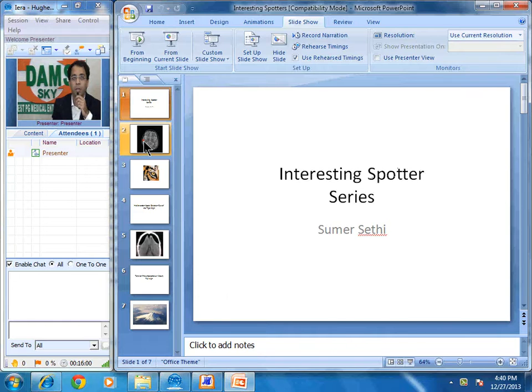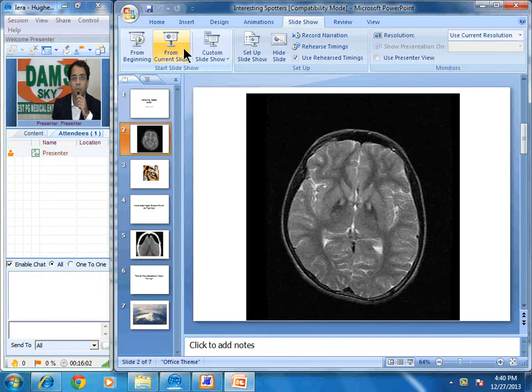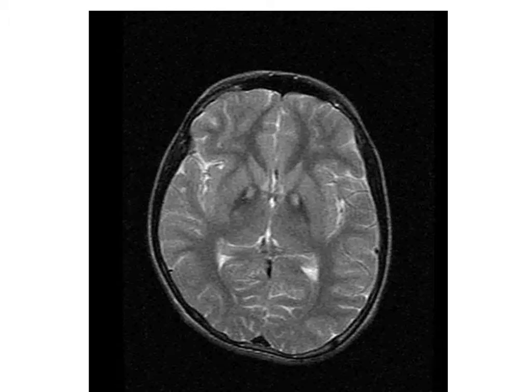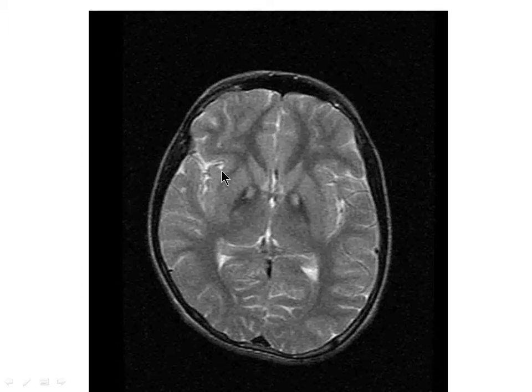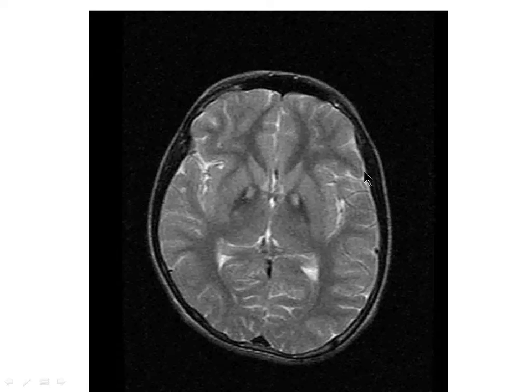The first case we want to see today is an MRI brain. Please look at this MRI image and tell me what sequence you think this is. This is an axial T2-weighted MRI image. This is a 14-year-old boy who presented with complaints of dystonia, and this T2-weighted MRI image is available to us.